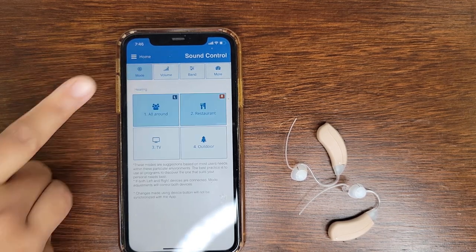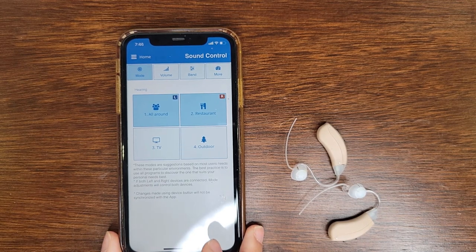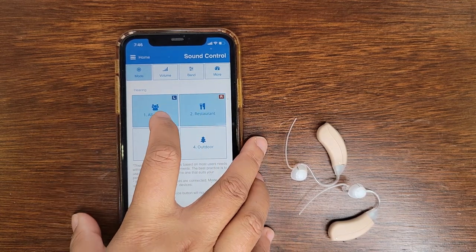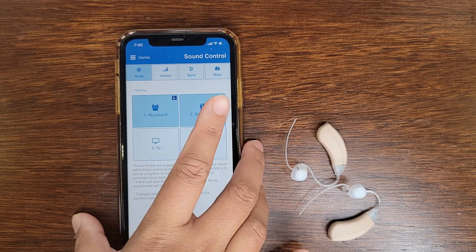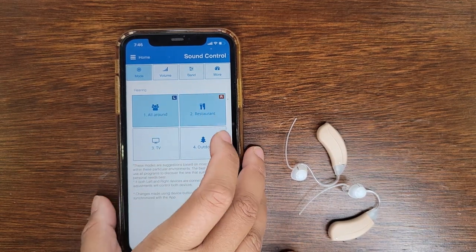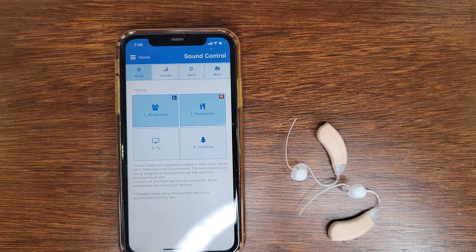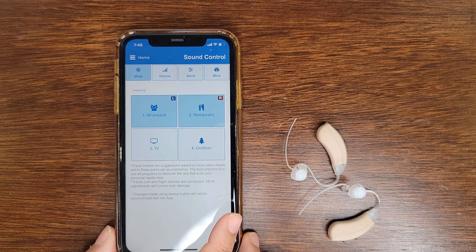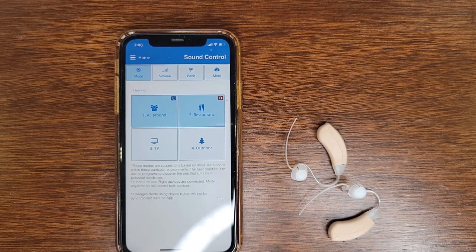So let's look at our mode tab. We have four different modes. We have all around, restaurant, TV, and outdoor. So over here I have all around for my left ear, and for my right ear I have a restaurant mode. So according to my test results, it's automatically updating what I need for my hearing aid, and it can do it individually as well.